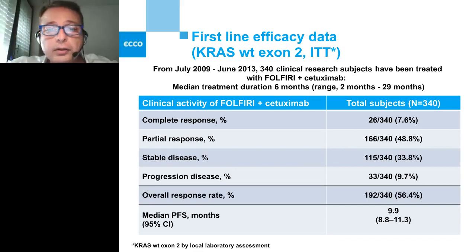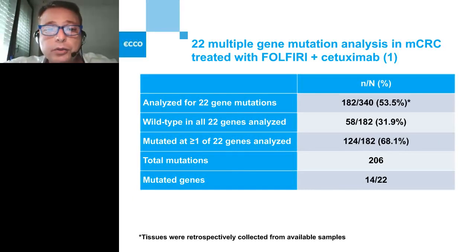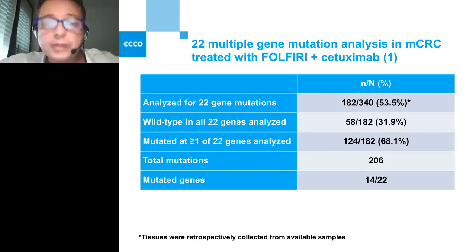And these are the results showing the frequency of the mutation, at least for the most frequently mutant genes that we found in our subset of cases. Now, the frequency of mutations of these genes, P53, KRAS, PIK3CA, BRAF, NRAS, MET, FBXW7, are in line with what has been observed in other studies and what can be found in a number of databases.